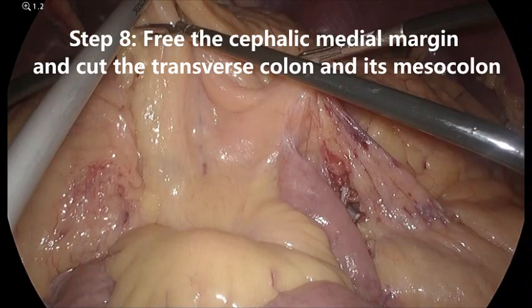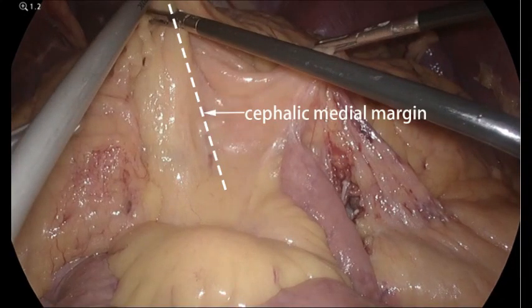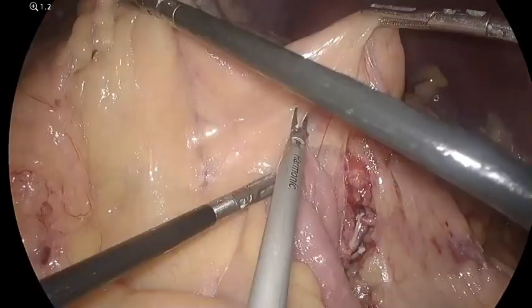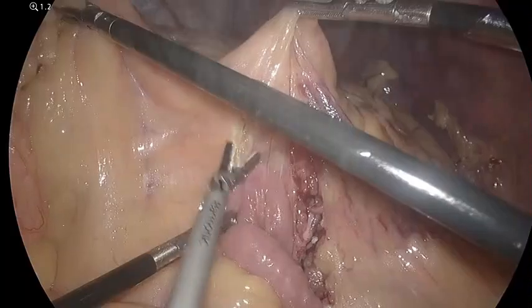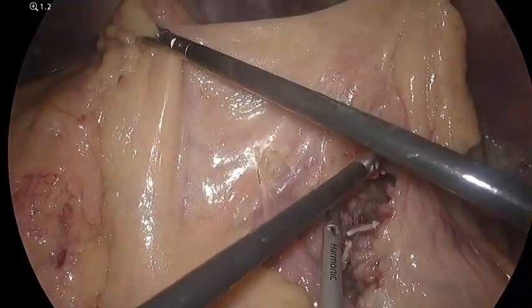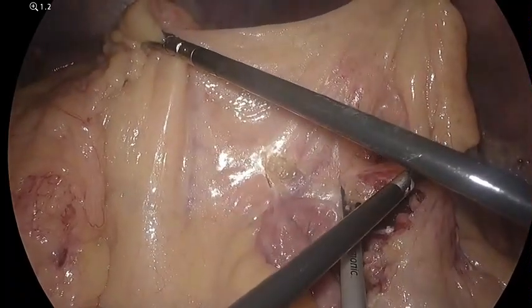Step 8. Free the cephalic medial margin. Sever the left branch of the middle colic artery and dissect along the left branch projection of the middle colic vessels to free the transverse colon to the line of anticipated colonic resection, completing the freeing process for laparoscopic left hemicolectomy.